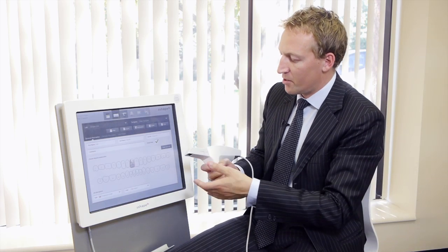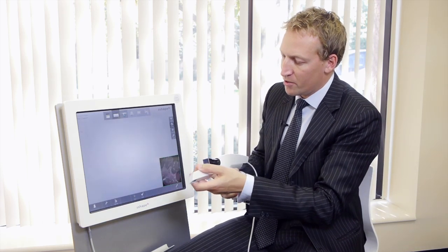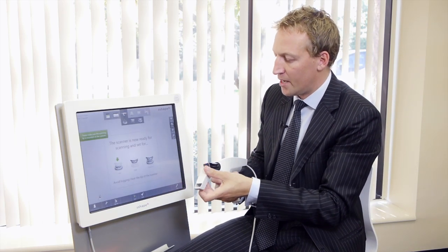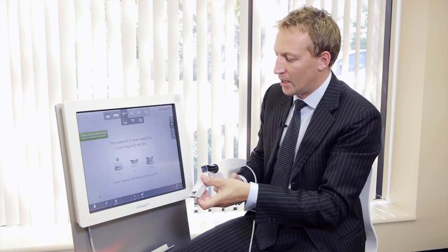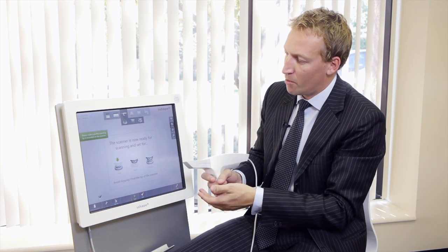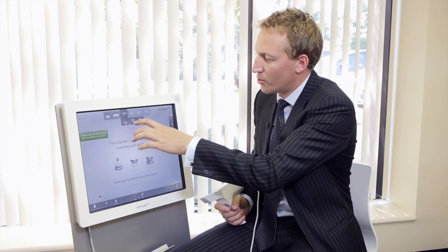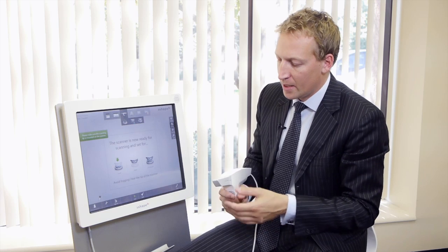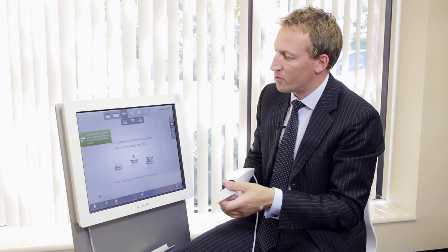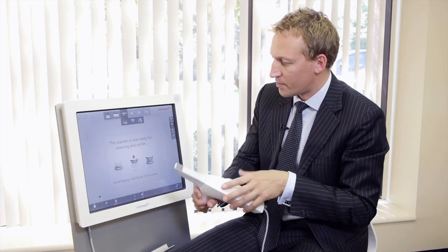And so I have the scanner here. We have the tip. We can go into the autoclave. And we can either point upwards. We use that typically for upper jaw scanning. Or downwards would be typically for lower jaw scanning.